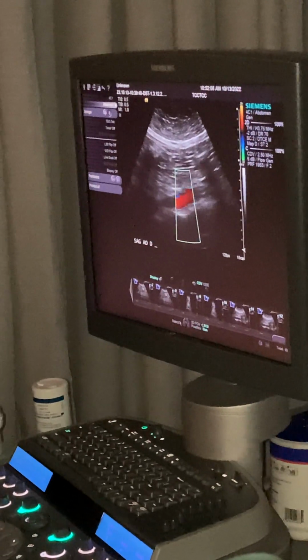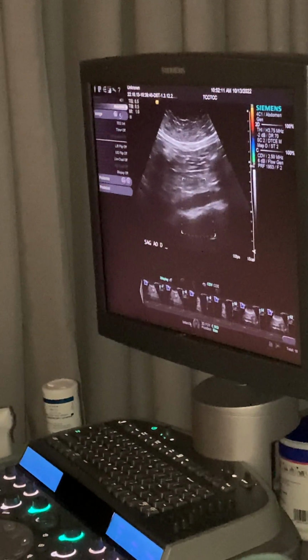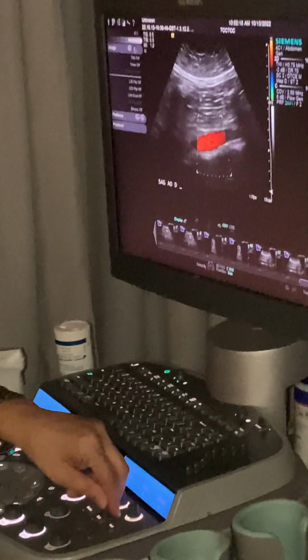Is it next? It's next. Let's open this up just a little bit. So now, okay, here's what color fill really looks like. You see we're still getting a little bit of that blue. So we're going to scale up maybe one more.